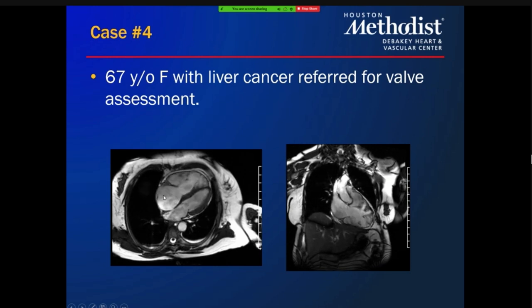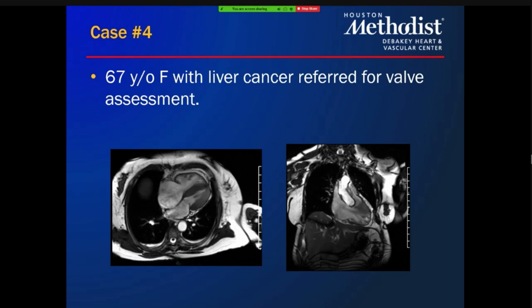Because of the 5-HIAA, the serotonin effects from the carcinoid, the tricuspid valve and the pulmonic valves have remodeled, and they're all tethered and fixed. They're no longer moving. And so this is rip-roaring TR, as you pointed out, that's caused RV and RA remodeling, so much so that it's now impinging on the left side. But this is a severe TR in the case of a carcinoid patient. Okay, very good. Thank you, George.